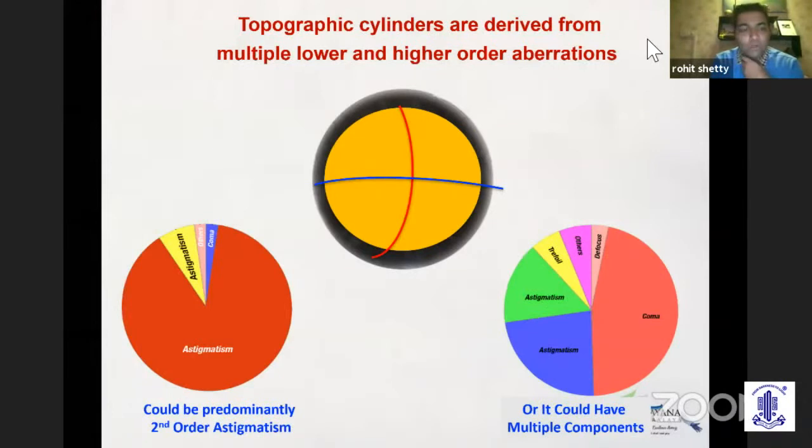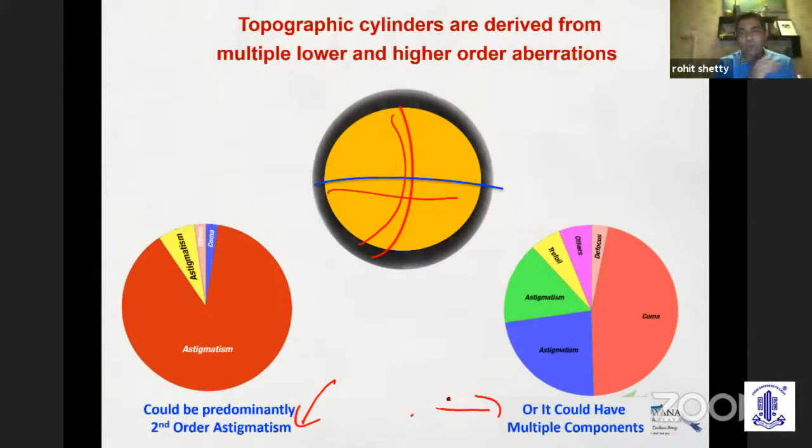The entire Contura is basically driven from this concept. The concept about the curvature is not just only the curvature, it's not just astigmatism, it's a mix of a pie chart which mixes the higher and lower order aberrations. And I'm not talking about keratoconus, I'm talking about normal patients. So how you correct this is different from how you correct this. And that's what Contura is completely based on.